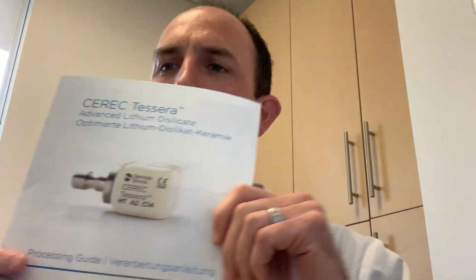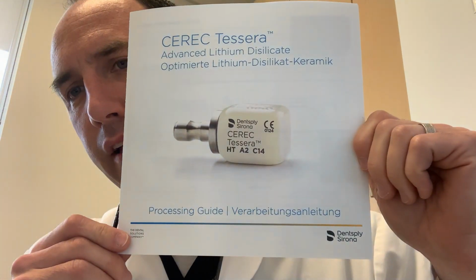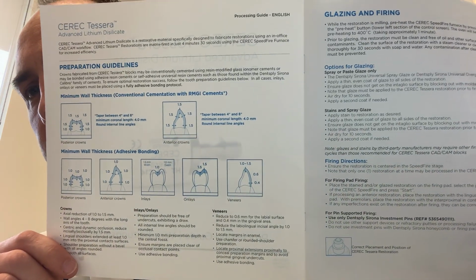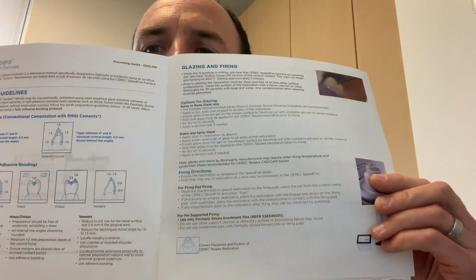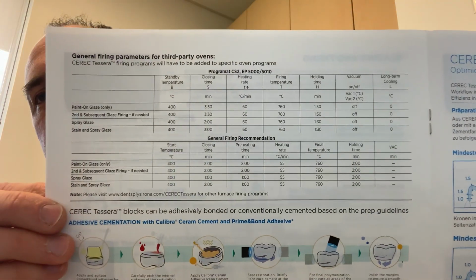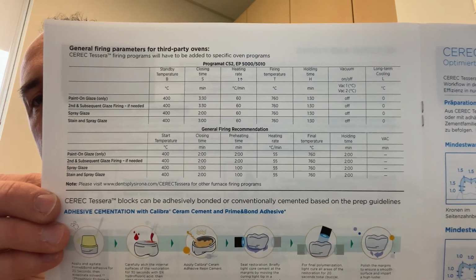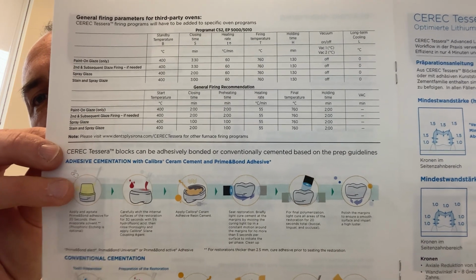And then a little programming guide, processing guide for how to set up your oven. For those of you that have a Speedfire, that should set it up on its own. For me, I have a CS and a CS4 oven. Here's the preparation guidelines for bonded and for not bonded, and some glazing and firing protocols. And then it gets you into this page right here, general firing parameters for third-party ovens. And then the bonding protocols down here.